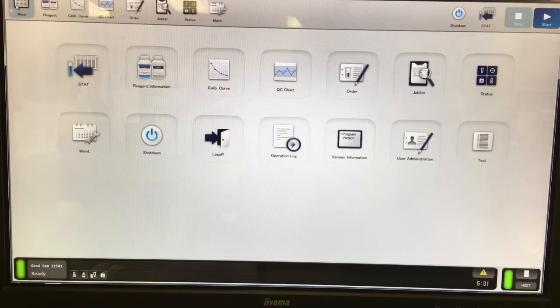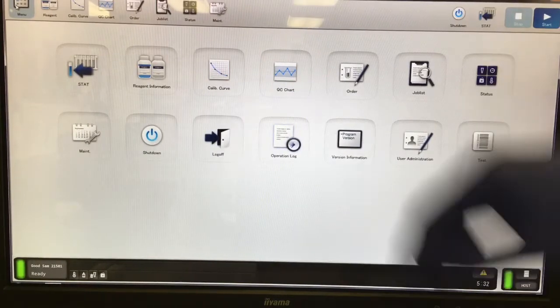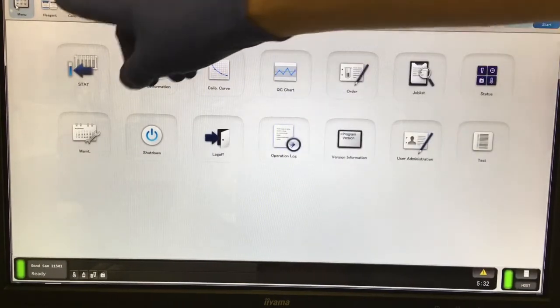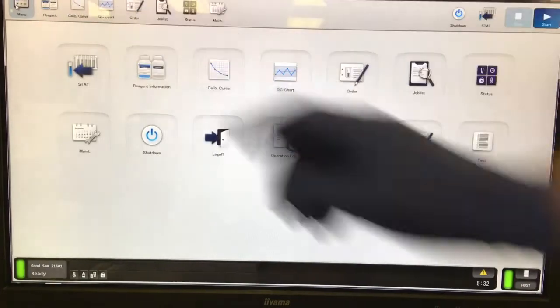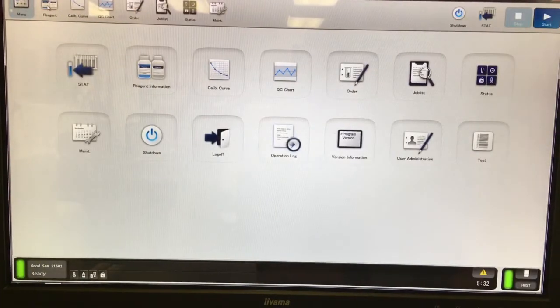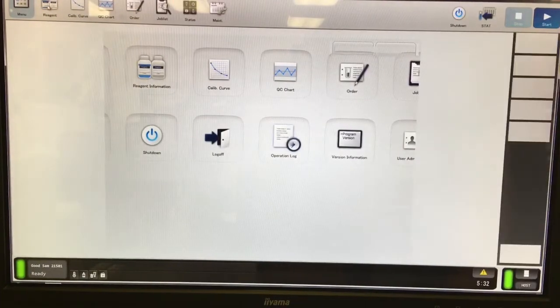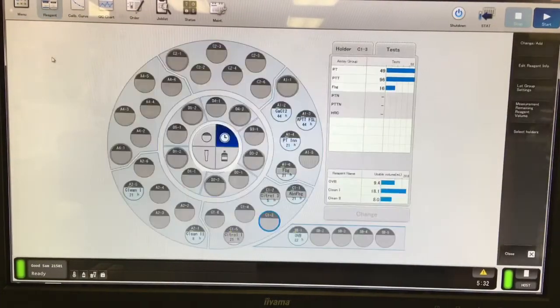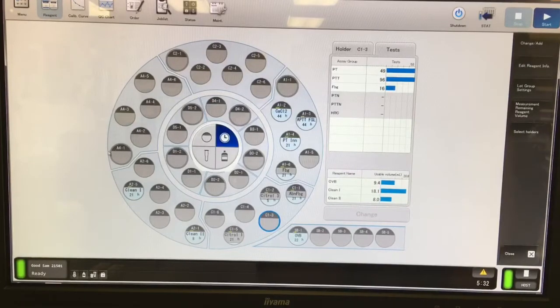In this video, I'm going to show you how to load and unload a reagent for the CS2500. Starting at the main screen, you can go to your quick tabs and select the reagent button, which will take you to the reagent display screen.